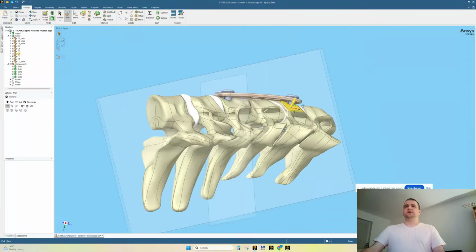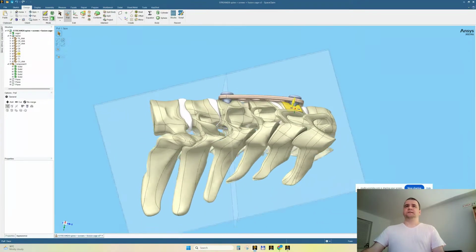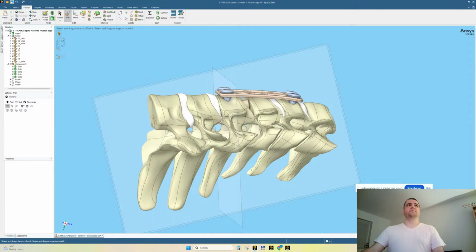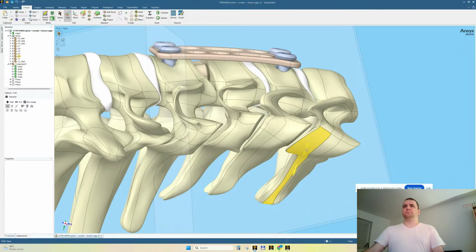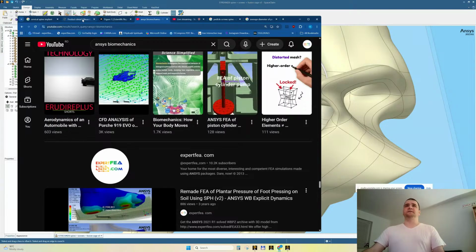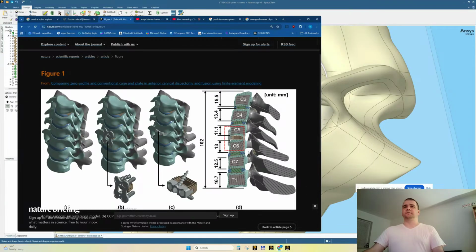So, ladies and gentlemen, I dare to say that we approach the end of the modeling. I'm curious if they made these cartilages here, because there are some cartilages here. Let's see if they made it in this paper from Nature. No. Between, yeah, here, no, they didn't make.